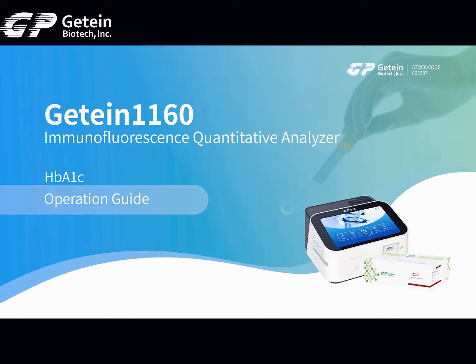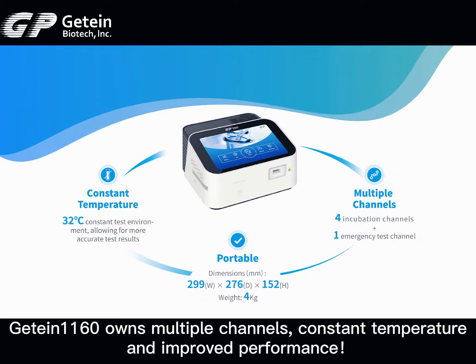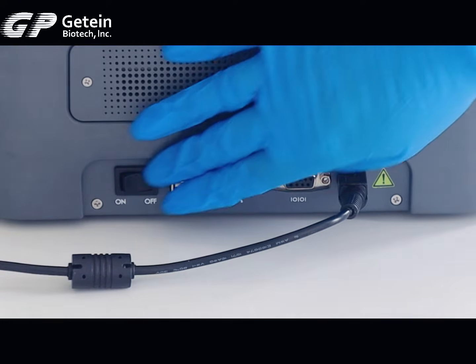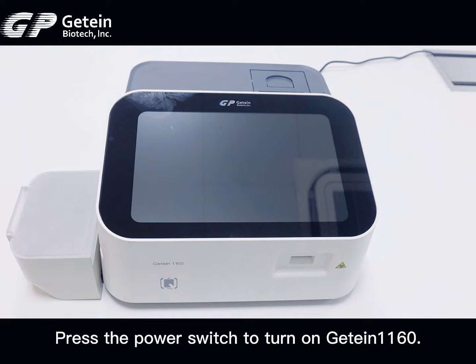GTIN1160 Immunofluorescence Quantitative Analyzer HBA1C Operation Guide. The GTIN1160 owns multiple channels, constant temperature, and improved performance. Press the power switch to turn on the GTIN1160.